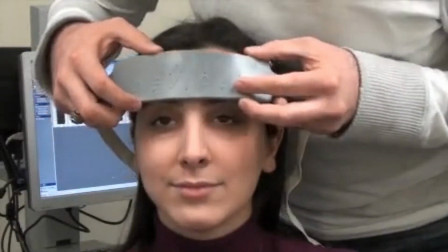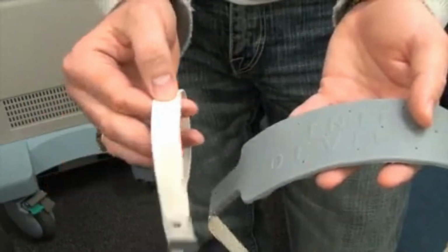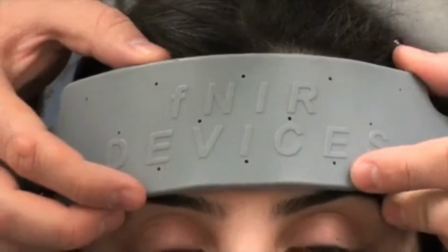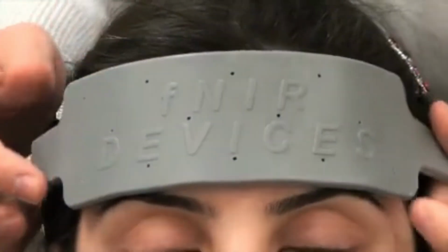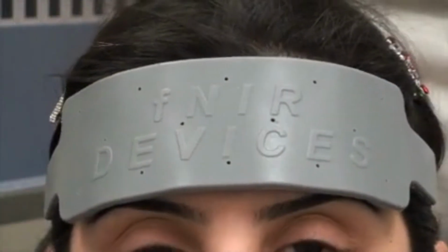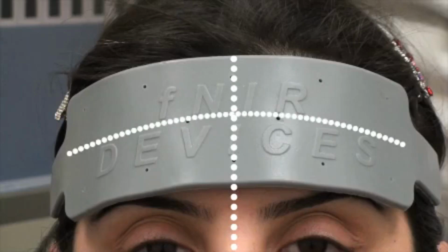The sensor pad is placed over the forehead of the subject. Side 1 should be on the subject's left, and side 2 on the subject's right side. The sensor should be placed just over the eyebrows and should be centered vertically. The imaginary vertical symmetry line passes through the midline of the forehead and then the nose. The sensor pad's center line coincides with the midline of the forehead and nose.